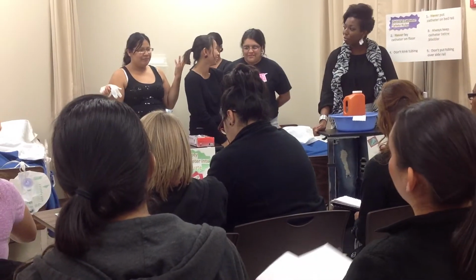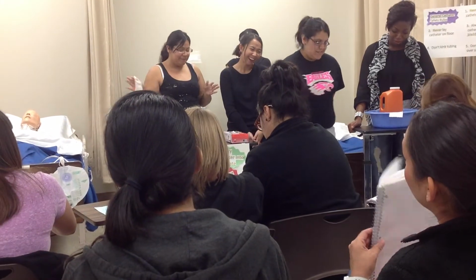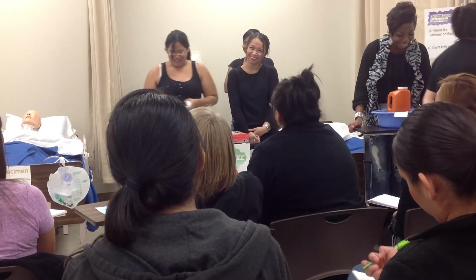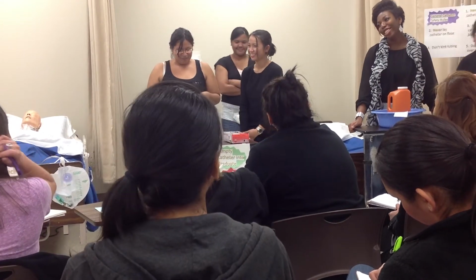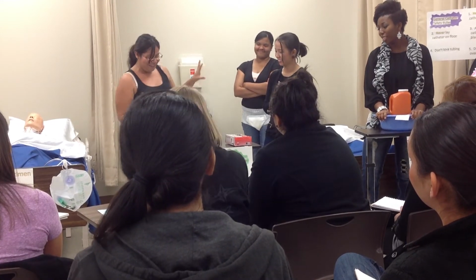Okay, so condom catheter, you're gonna apply it like you're applying a condom. Okay, you're not gonna detach the penis from your patient. You're gonna leave it on him.